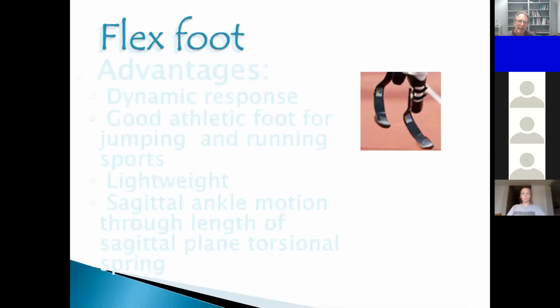Okay, here is the type of feet that you actually see with athletes, at least while they're doing this. Now, there's a thumbs up gesture. There's a button that you can use that gives a thumbs up gesture.